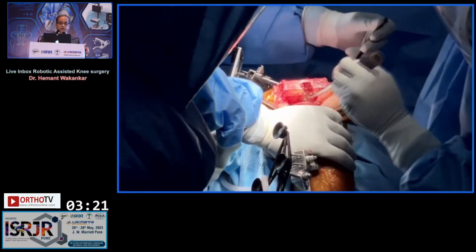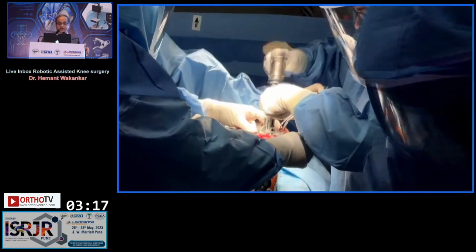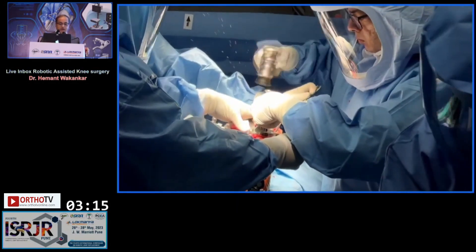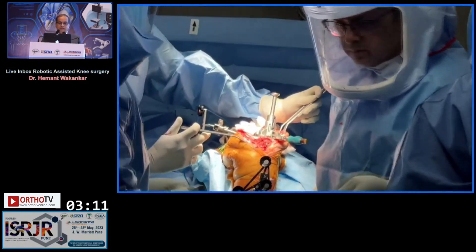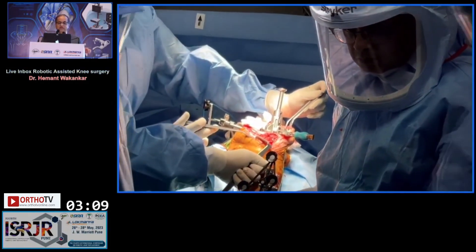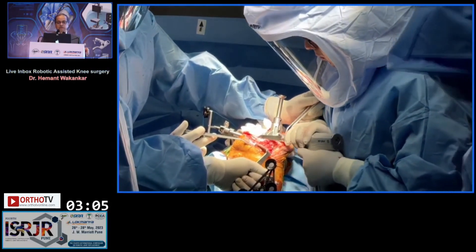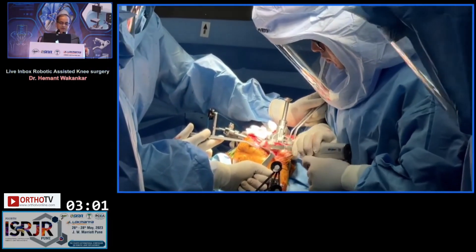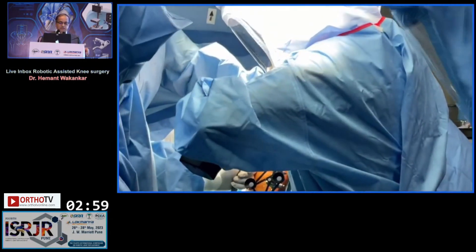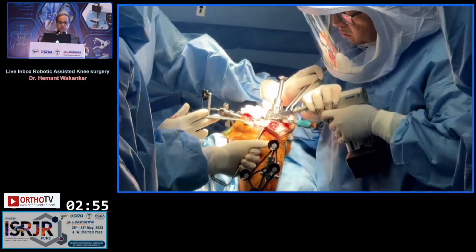Next step is tibial preparation, doing the reduction osteotomy, and a trial reduction. I've prepared the tibia. After putting my broach in, I'm going to knock off the medial osteophytes and do that small amount of reduction osteotomy. That is going to give me the medial release and get me my balance. The medial side is being resected using a reciprocating saw.